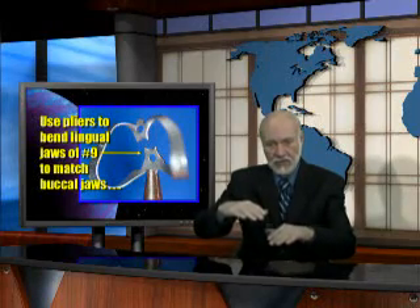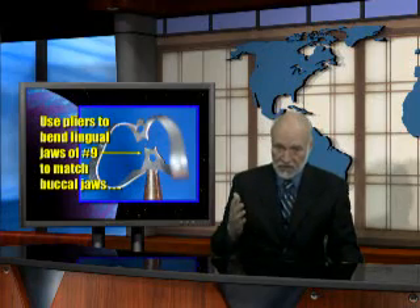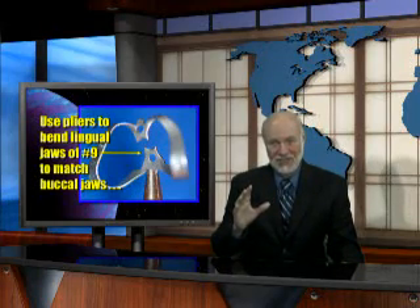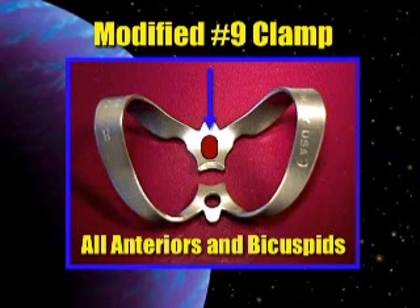If the clamp jaws are offset, it will slip over to the side and you'll have a very difficult time getting it off. The other thing I learned quite by accident, but it's very important, is that you will have to modify that number 9 clamp by enlarging the hole on the lingual side. The lingual is this jaw right over here. The large wings go to the lingual, and if you don't enlarge that hole, you'll find you cannot get this clamp back off of a molar or a bicuspid. So be sure and make that little hole a little bit larger. Modify that hole, make it larger, and you'll have no trouble going from clamp to clamp.